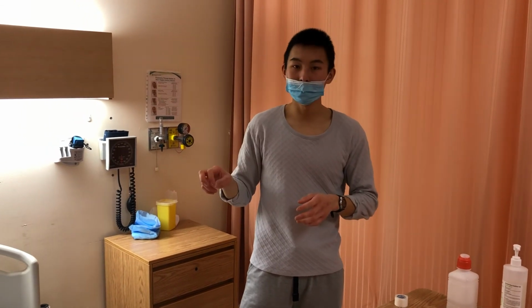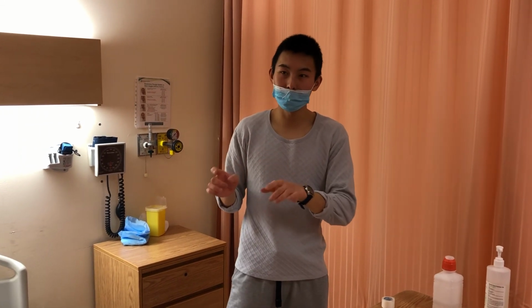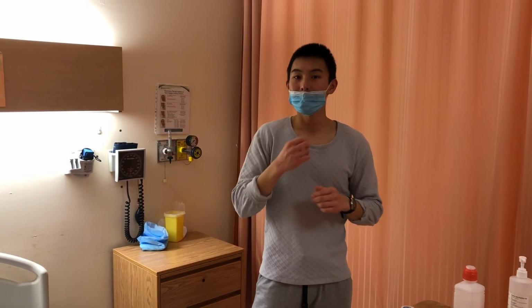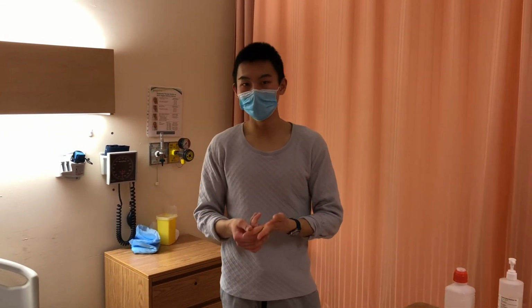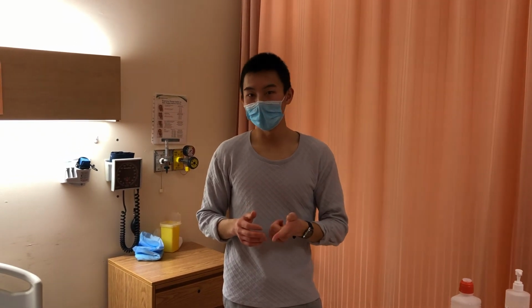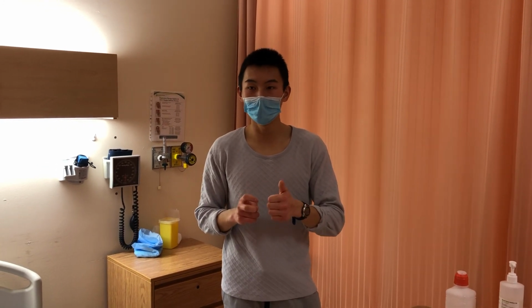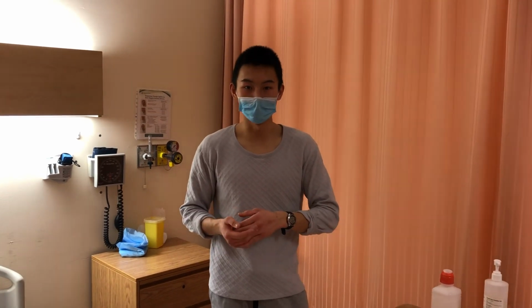After I dried the peri-wound skin and assessed it, I then put on my packing, which is a 4x4 soaked in normal saline. And I put on my outer dressing, which is a 4x4 and abdominal pad, and then taped up. And my plan for now is just to continue twice a day as needed, as per physician's order, regular care for the wound, which is irrigate, dry peri-wound skin, assess, put new packing and new dressing on. And each time I do it, I'll make sure to assess the wound parameters and assess the patient's pain tolerance level to this left thigh laceration. Thank you.